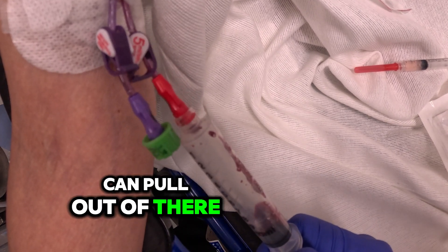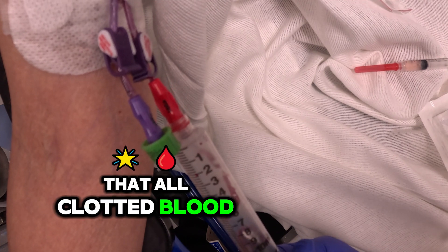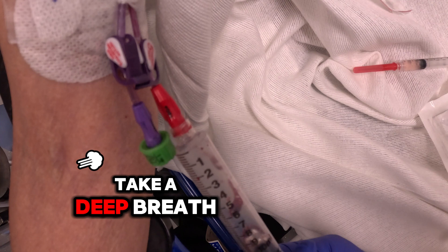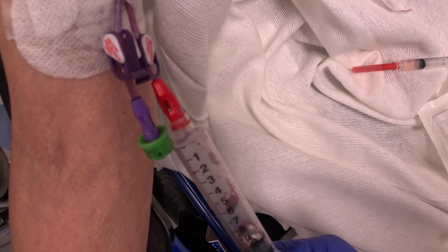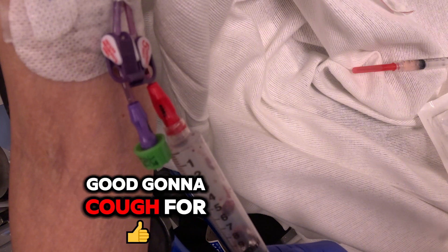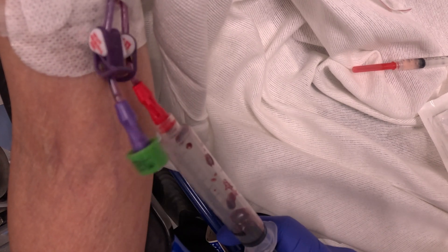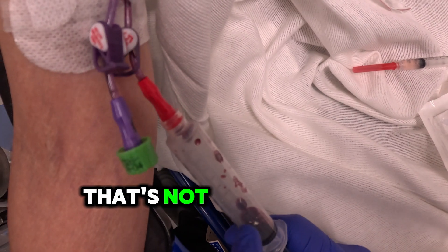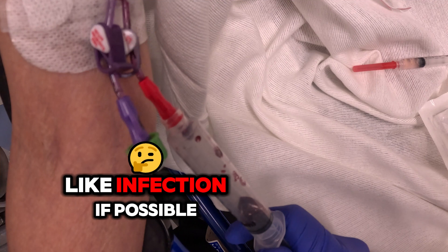I'm going to hold pressure and see what else we can pull out of there — that old clotted blood. Give me a cough. Take a deep breath in, hold it, and then relax. I'm just holding that negative pressure, trying to suck out as much of that old clot as possible. I'm trying my best not to push in all that old clot. Not that it's going to be dangerous — you see it's like jelly — but stuff might've grown in it, so I'm trying to prevent infection if possible.